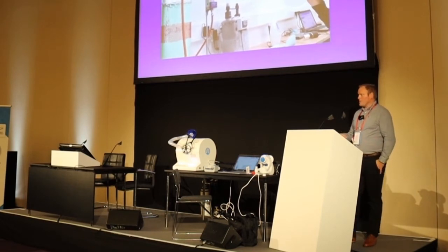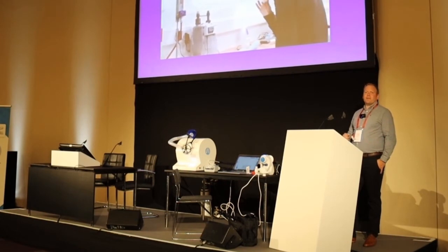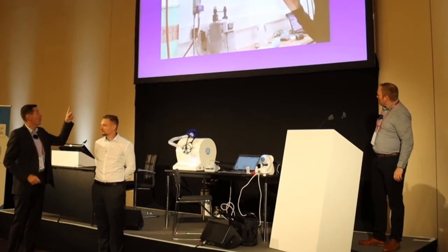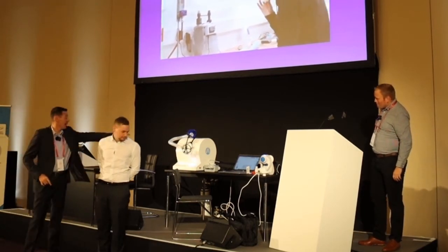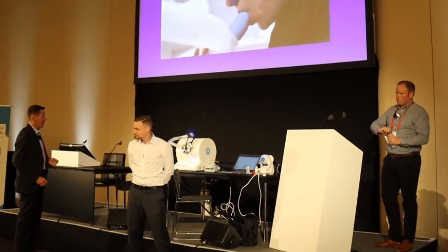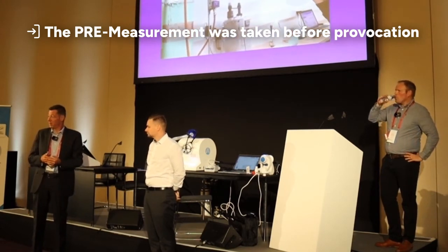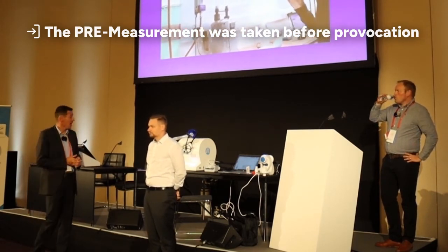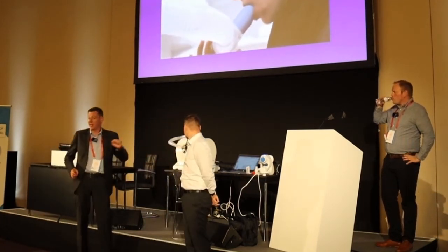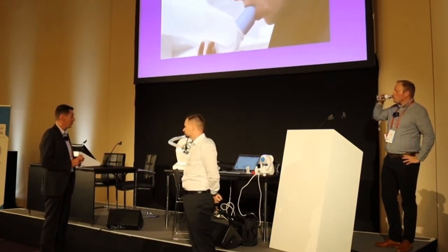If I stop presenting there, I think Benjamin's going to be our guinea pig today. Christian, you want to come up? The equipment you can see here is more or less implemented in this Eucapsis device. The method is absolutely equal, and we already did a pre-spirometry test. We have the FEV1 parameter available. The advantage is that you can just set up the target ventilation in the device, and you can observe graphically on the display how it works.